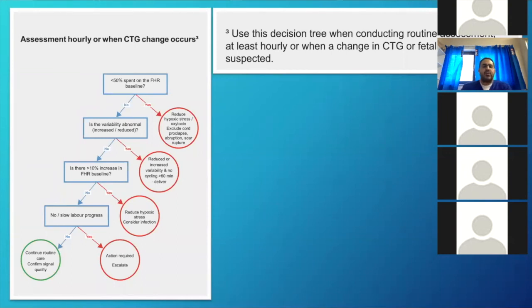Now you have to understand that the STAN machine does not alarm if you have one abnormal cross. The minimum alarm happens when there is at least 4 minutes of abnormal baseline or abnormal ratios. So if you have a cross that is happening once every 5 minutes, then the reality is that you can have problems that are lasting for 4 minutes and you have no STAN alarms.